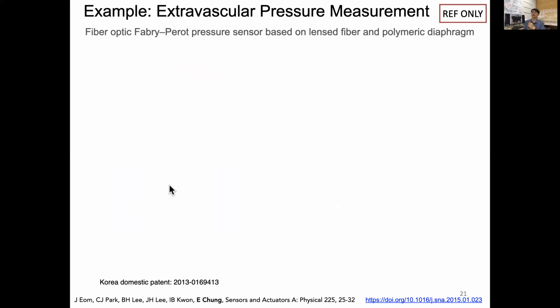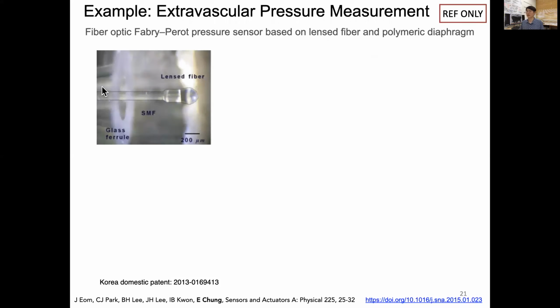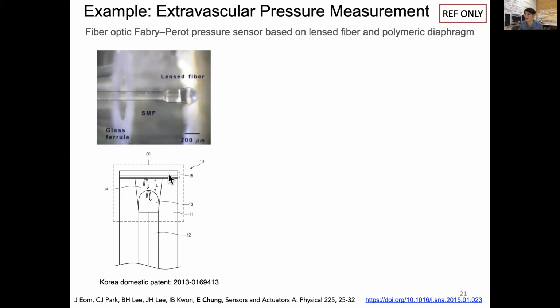I want to give you an example of extravascular pressure measurement, which I happened to be involved in: making a fiber optic-based pressure sensor based on a lensed fiber and a polymeric diaphragm. We created an optical fiber where the light goes in and a lensed fiber was made, and that fiber reflects from a polymeric diaphragm, which is a polymer so that it responds to pressure.